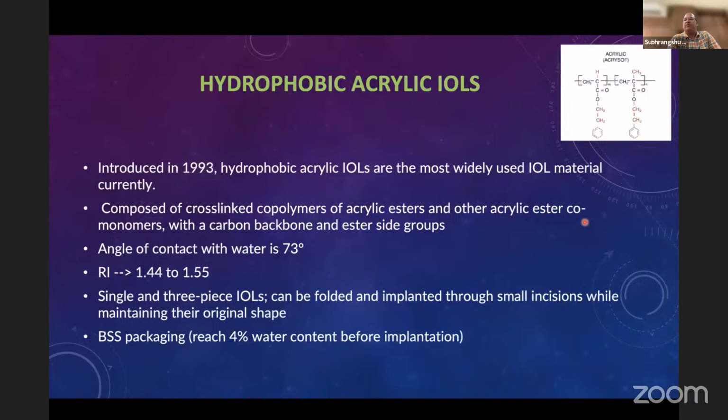Coming to the hydrophobic acrylic IOLs. They were introduced in 1993, and they are actually the most widely used IOL material currently. The angle of contact with water is 73 degrees. They can be in single or three-piece design. They can be folded and implanted through small incisions while maintaining their original shape.